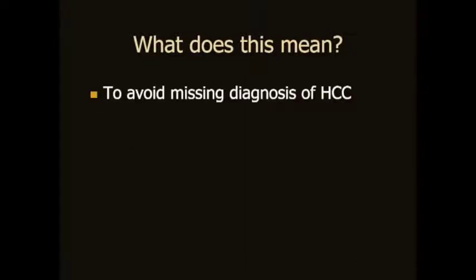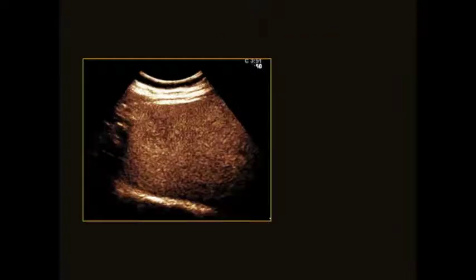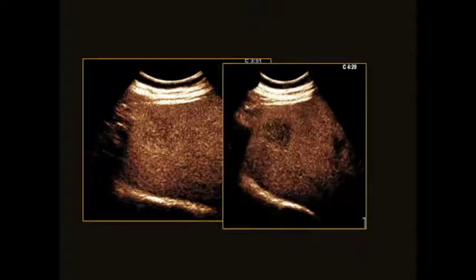But what does this actually mean? Well, to avoid missing the diagnosis of hepatocellular carcinoma, we have to watch for a longer time. And with the contrast agent that I'm using, it's 5 minutes for sure. And so here we're still looking. You can see just before 4 minutes, is there vague, perhaps early washout on this lesion? And at 4.5 minutes, it's unquestionably there.